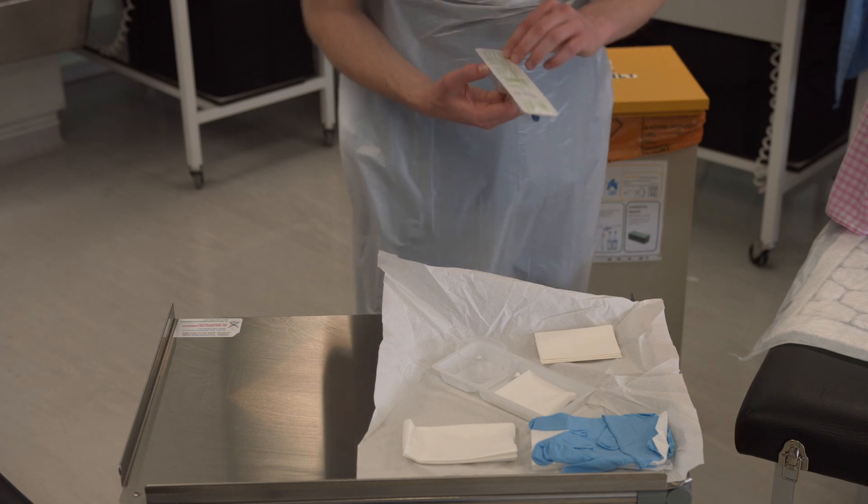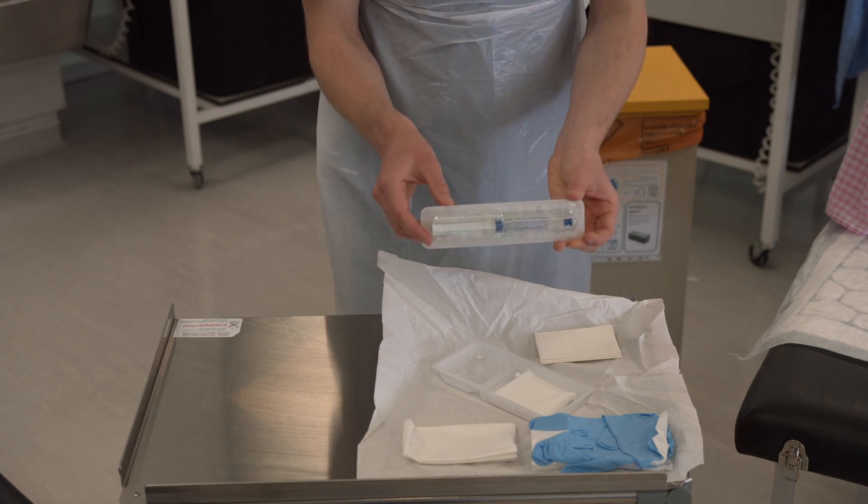Take the lubricant out of its packet and then drop it onto the sterile field.